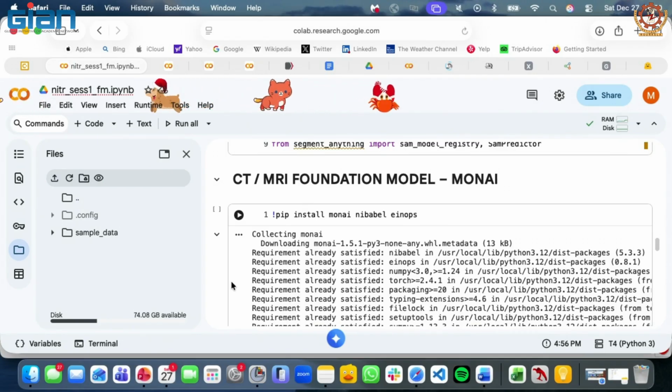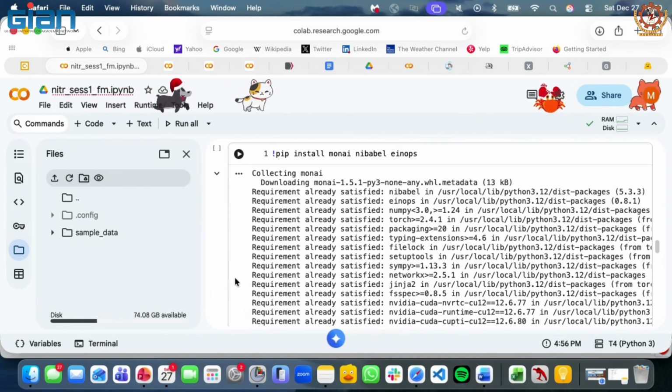So for bioinformaticians or biomedical informatics students like you, you don't have to write the code explicitly now. Your task is to run the inference and work on the results mostly. So if you are using MONAI, that basically simplifies your life. You don't have to deal with much back-end coding.